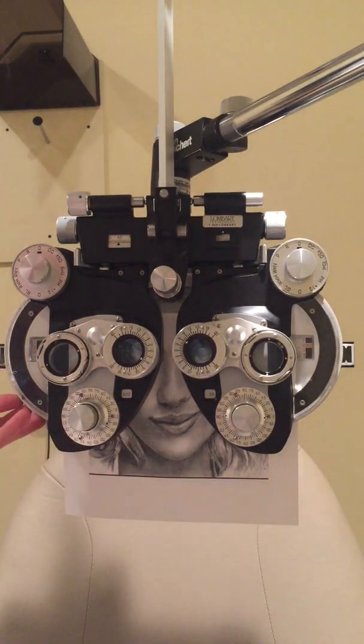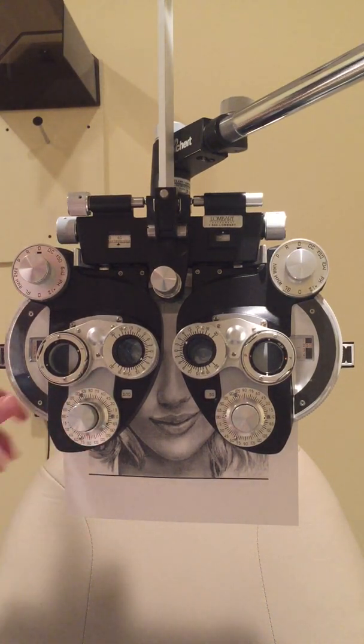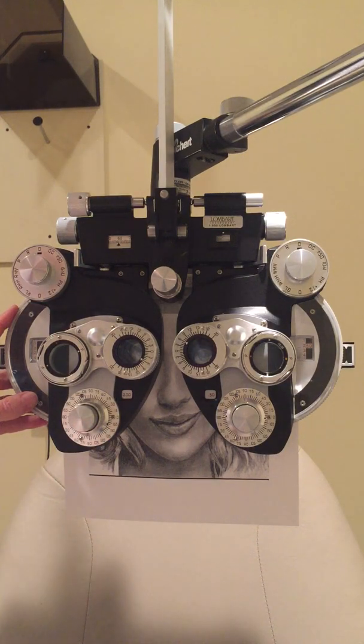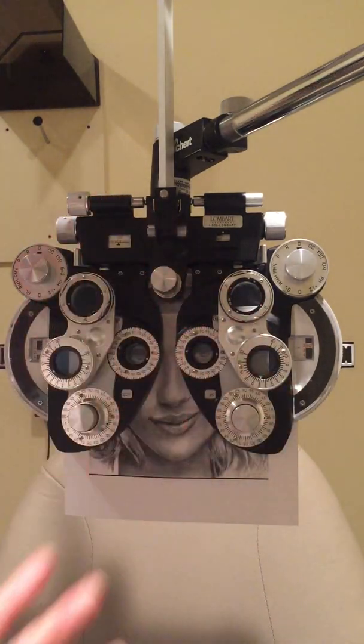I hone in on the balance point. Since asking which is 'most equal' is too hard for the patient, I instead continue the top-or-bottom comparisons. Adding a bit more minus to the right eye, she's unsure — that's my end point where the two eyes are approximately equal. I remove the prisms and show her the full chart down to 20/20. She can't read the bottom row, confirming she's still in the plus fog.